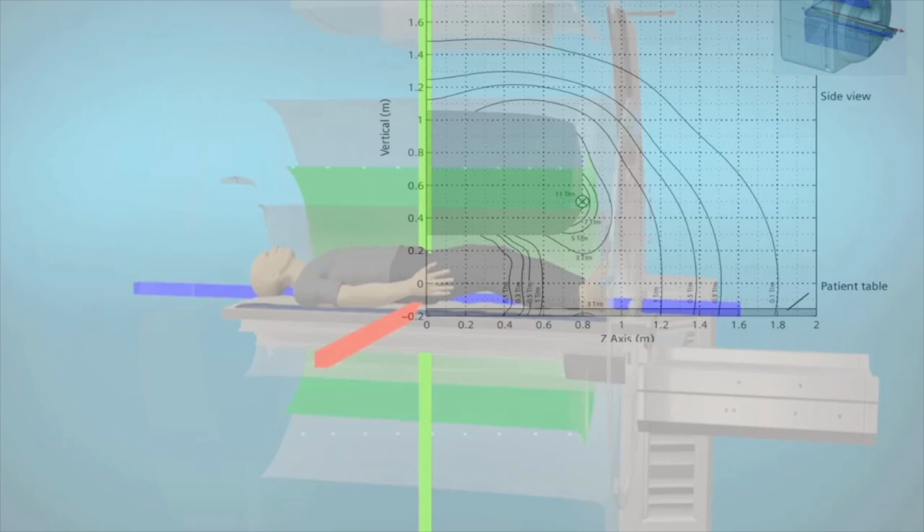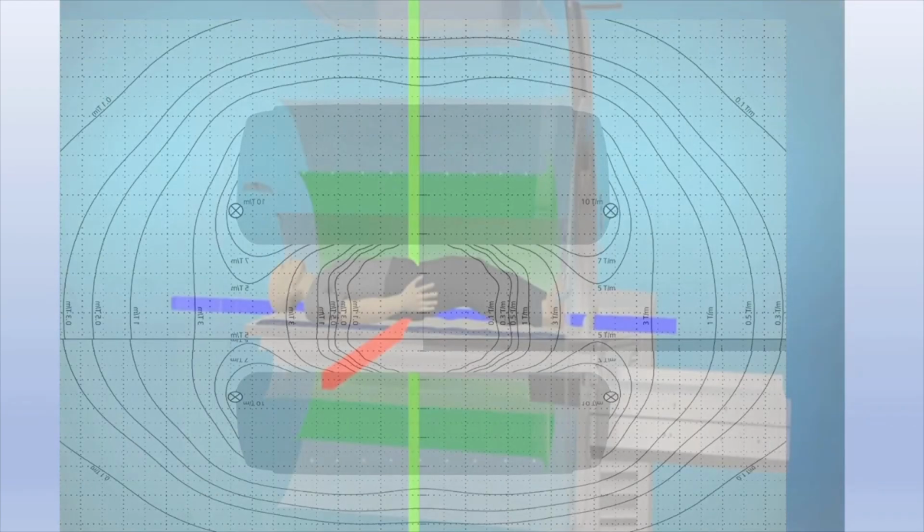You'll be able to see, remember, this is the area that has the largest slope across space in the change in the magnetic field. So you'll see here at isocenter, there is no spatial gradient like we were talking about before. Let's open this up even a little bit more. There we go. So now you'll be able to see that everything originally that we would see, you can fillet it open and see what this would be in 3D space, or at least 2D space flipped. So it can be a little bit confusing when it comes to your overall spatial gradient maps, but just imagine it like this and it becomes a lot more clear.